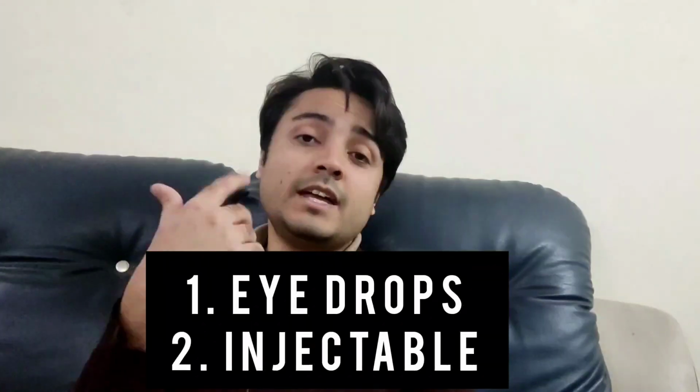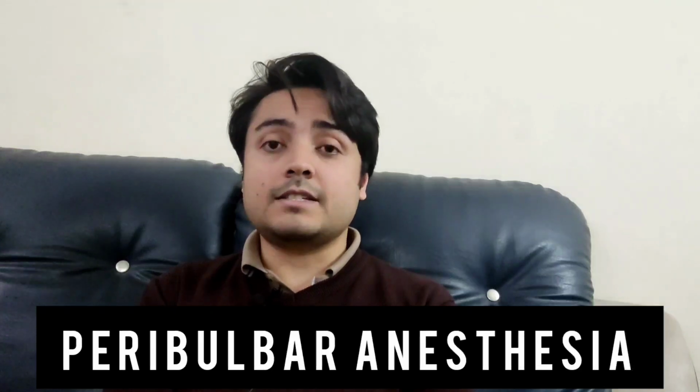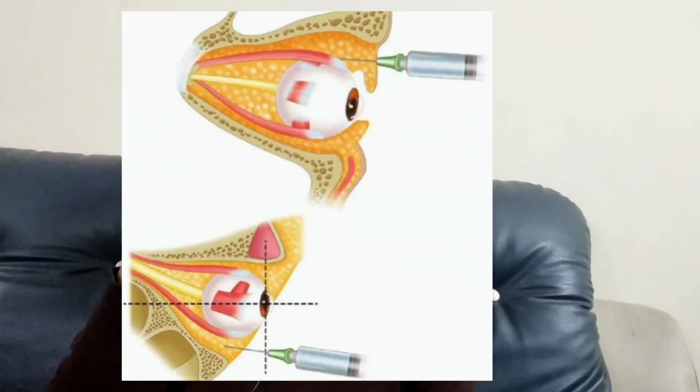You can either use eye drops, the patient can undergo this procedure with the use of eye drops, or you can go for injectable anesthesia around the eye, which is known as peribulbar anesthesia. As the name suggests, peri means surrounding, bulbar the eye globe. So we surround the eye, either on the lower side or on the upper side. This anesthesia works fairly well for the amount of time required for this procedure. With this anesthesia, a person is usually scared. He says, maybe I can injure the eyeball. Well, in experienced hands, it is fairly uncommon.